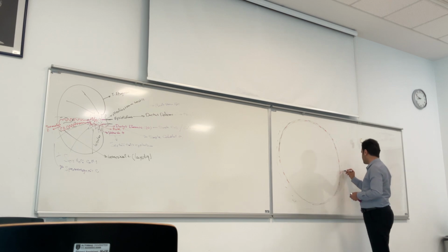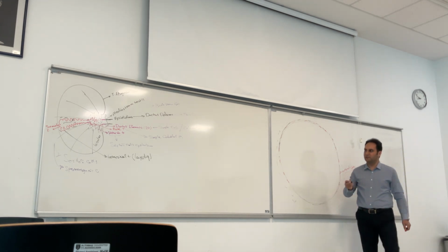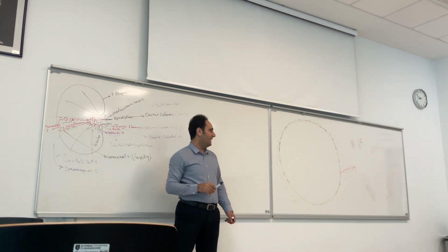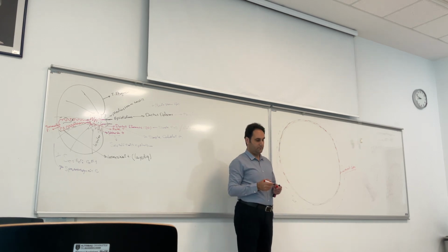These are myoid cells, present in the wall of seminiferous tubules, in this part, this wall. And this area is known as the tunica propria.